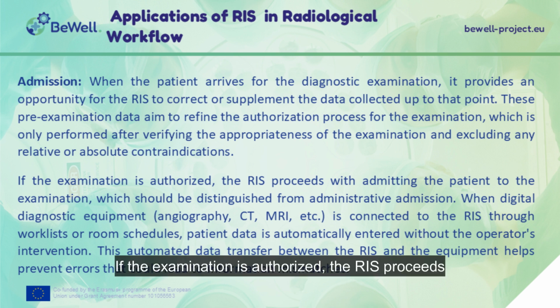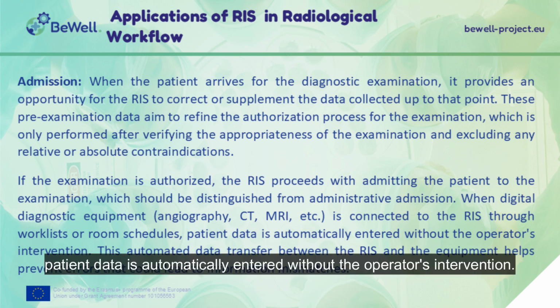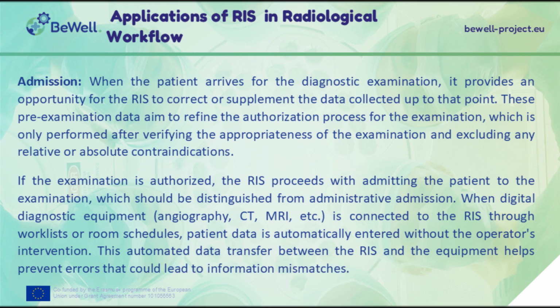If the examination is authorized, the RIS proceeds with admitting the patient to the examination, which should be distinguished from administrative admission. When digital diagnostic equipment, angiography, CT, MRI, etc., is connected to the RIS through work lists or room schedules, patient data is automatically entered without the operator's intervention. This automated data transfer between the RIS and the equipment helps prevent errors that could lead to information mismatches.